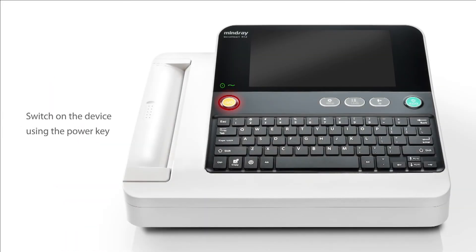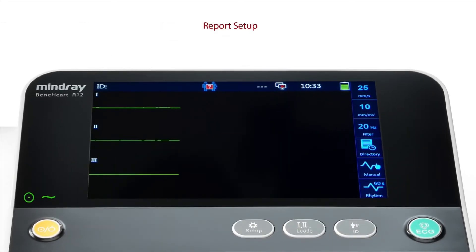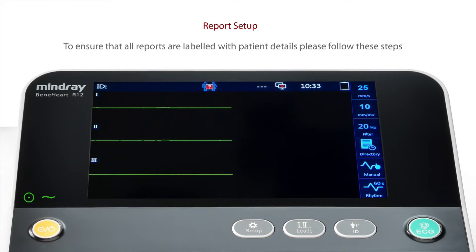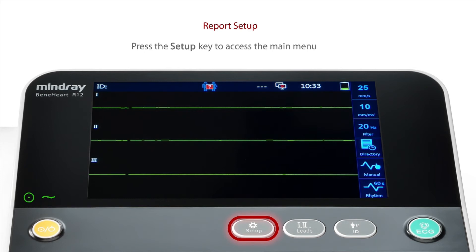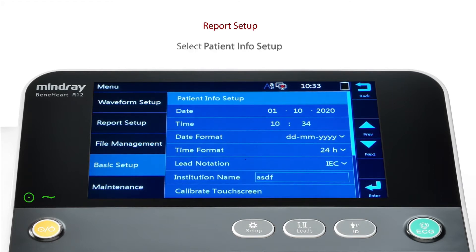Switch on the device using the power key. To ensure that all reports are labelled with patient details, please follow these steps. Press the setup key to access the main menu. Using the keyboard arrow keys or the touch screen, select Basic Setup. Now select Patient Info Setup.